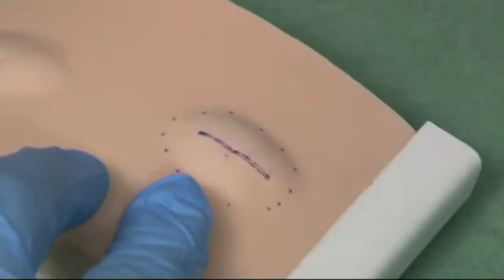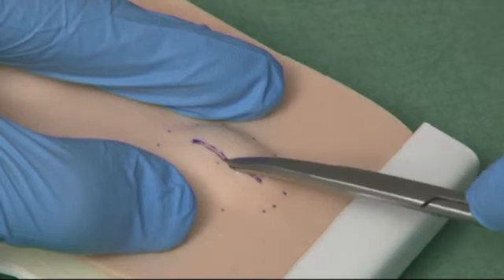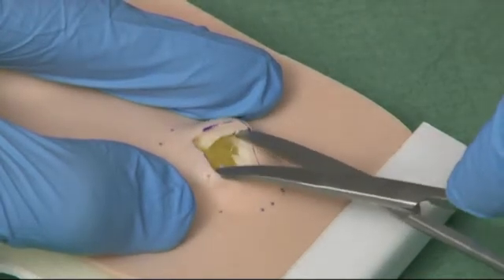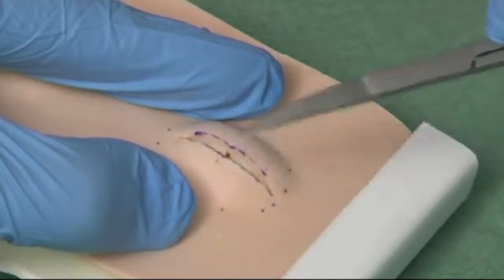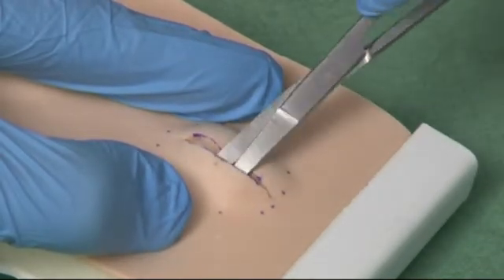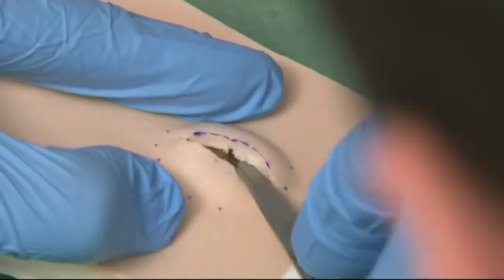Next, take the curved dissecting scissors, holding them with the curve downwards, and spread them over the top of the lipoma, bluntly dissecting it free from the surrounding tissues. Continue spreading the dissecting scissors over the lipoma and down both sides, freeing it all around.